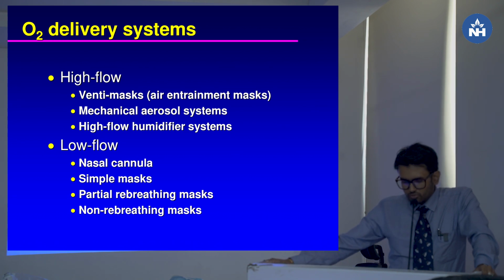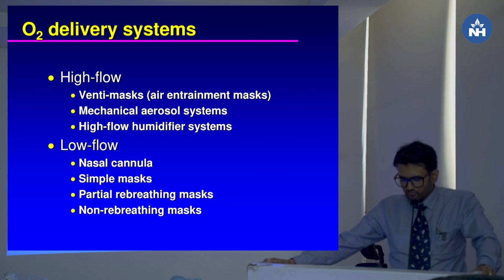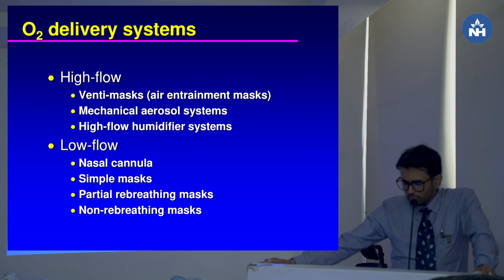High flow consists of venturi mask, mechanical aerosol system, and high flow humidifier system. Low flow consists of nasal cannula, simple mask, nasopharyngeal catheter, partial rebreathing mask and non-rebreathing mask.